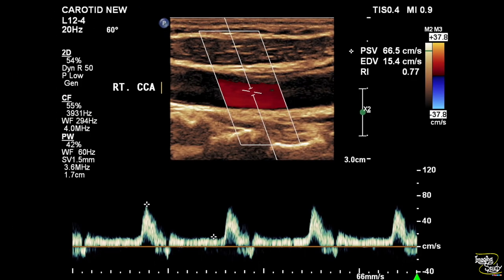Here's the right common carotid artery, which shows a multiphasic wave pattern. The flow velocity is within normal limits.